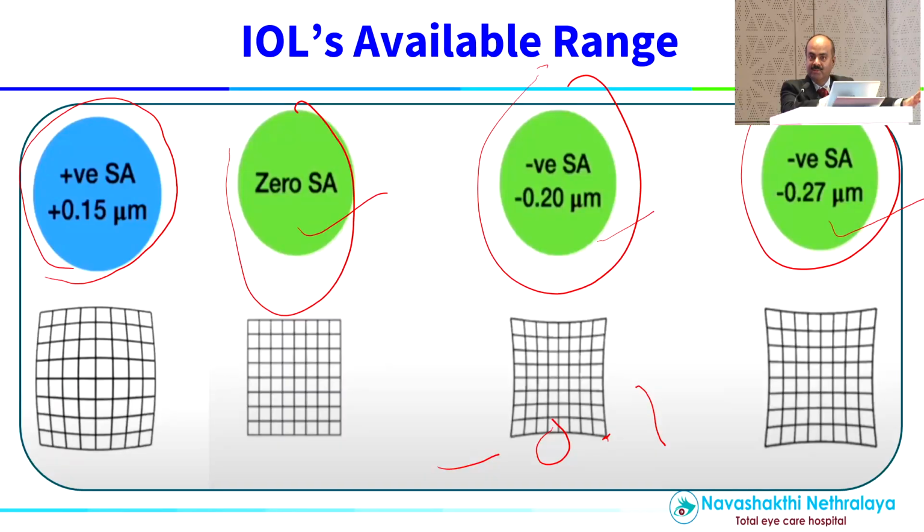If you are using a monofocal IOL and you want to give some kind of multifocality to this patient, target 0.3. Simple mathematics, but you need a Pentacam, or I use a Pentacam, but better would be an iTrace. iTrace is obviously the best, I don't have it.